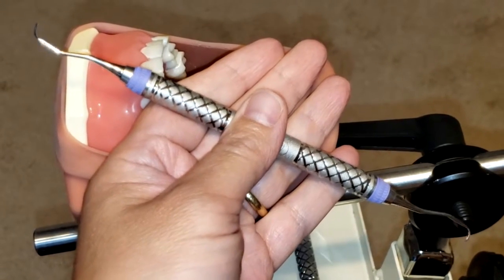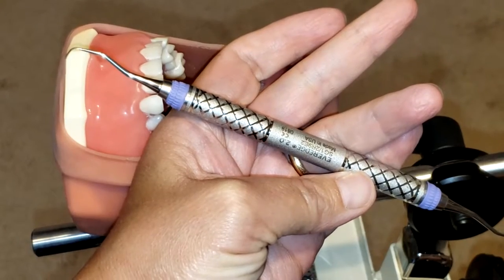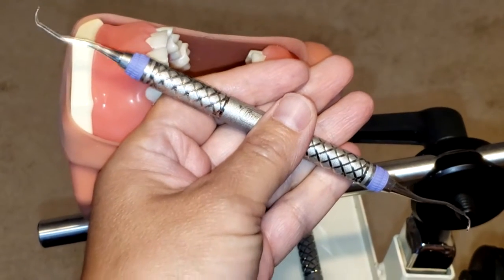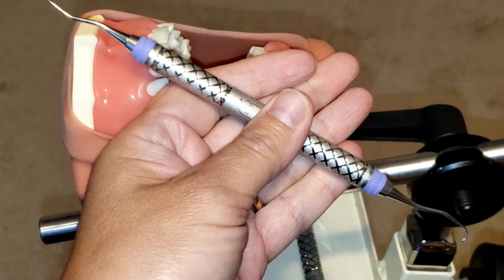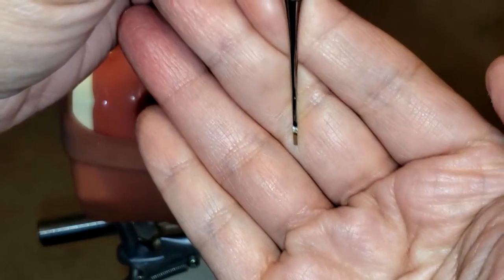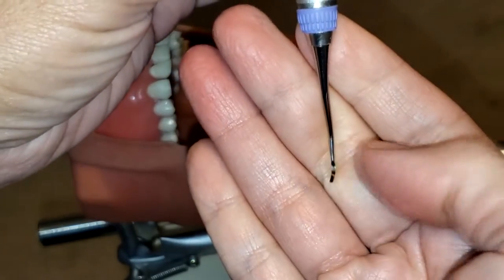Hello everyone and welcome. Today I'm going to be showing you how to use the Gracey 1-2 curette. This is an anterior instrument used from canine to canine for moderate to heavy calculus removal. It is a periodontal instrument used subgingivally, and as a curette it has a rounded toe, a rounded back, and one cutting edge per side.